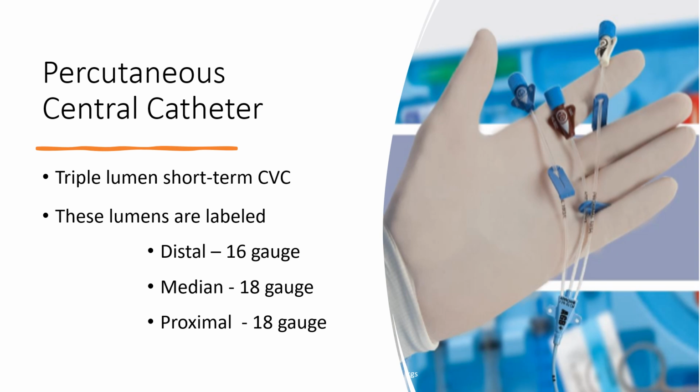There are staggered exit points or ports, which reduce the risk of mixing incompatible drugs and solutions that could precipitate. On the hubs, the maximum flow rate and pressure injection information will be clearly marked.